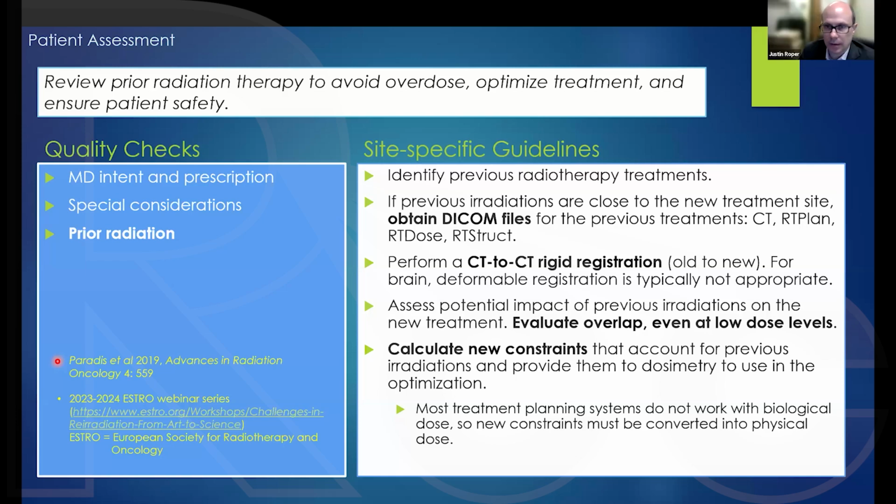Yes. All right, so for some reason my slides aren't moving. I can't switch to my next slide. All right, so the question is: the first item to complete when performing a quality check is, and the options are: inspect the DVH to determine if OAR constraints were met, review image registrations, perform a second check calculation of the plan, or review the patient's medical history.